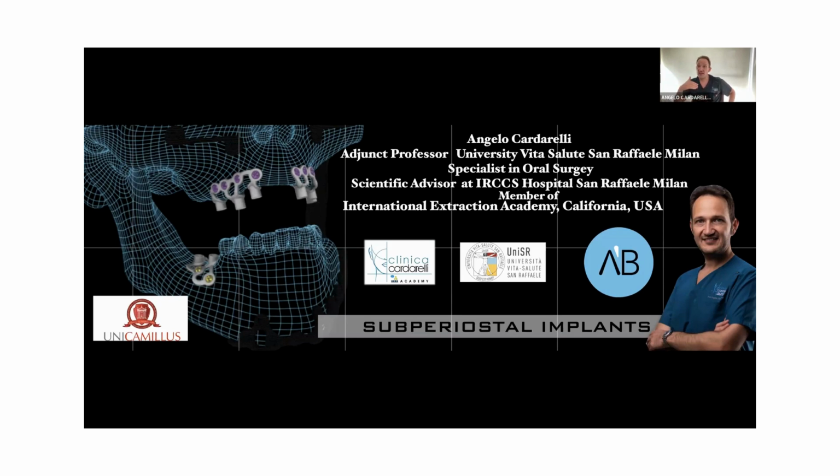And today I will share with you and show some cases using the customized and subperiosteal implant. This is a new approach in order to treat patients in which we don't have enough bone. So, challenging cases that we can treat now using customized implants. And I will show how we can do it.